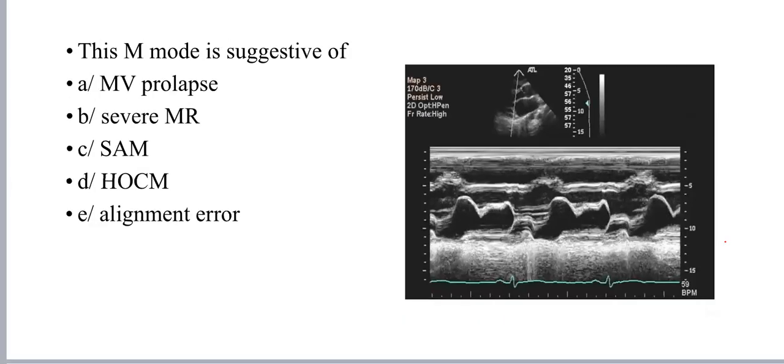And as you see here, it's not holosystolic prolapse, right? Yes. It's late or mid prolapse. So it's not holosystolic prolapse. This is again important.